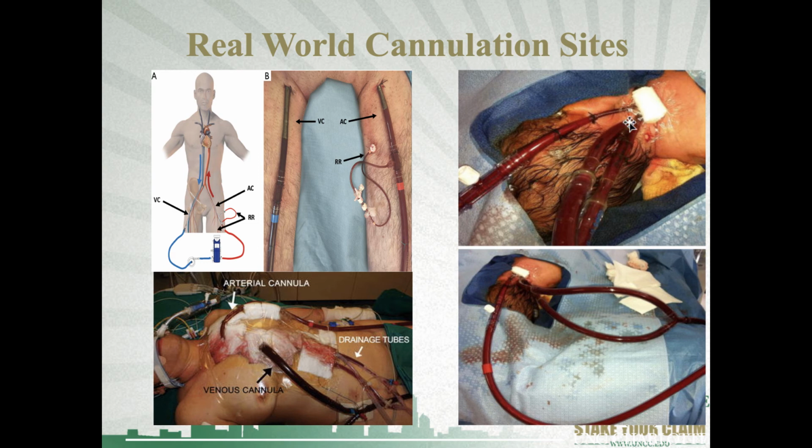So here we have venous blood being pulled out of our dual lumen catheter. This is kind of beyond the scope of what we're doing. And it's being returned to augment this patient's flow and cardiac support to the right common carotid artery. With this configuration, you're going to have your antegrade flow, and you're not going to have that many issues as you would with a FEM-FEM configuration.